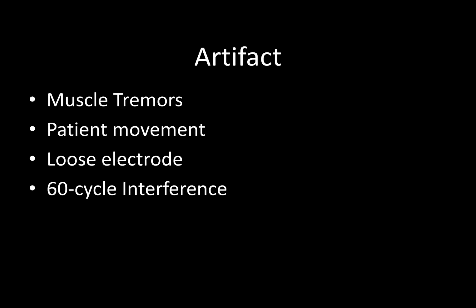I want to take just a moment here early on to talk about a handful of rhythms that occur quite frequently, but they're not actually arrhythmias. They're just unique things that show up on EKGs that can either give you a poor reading or just make it harder to interpret strips.